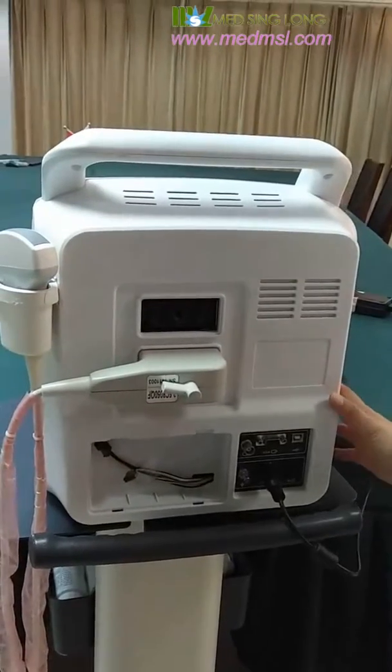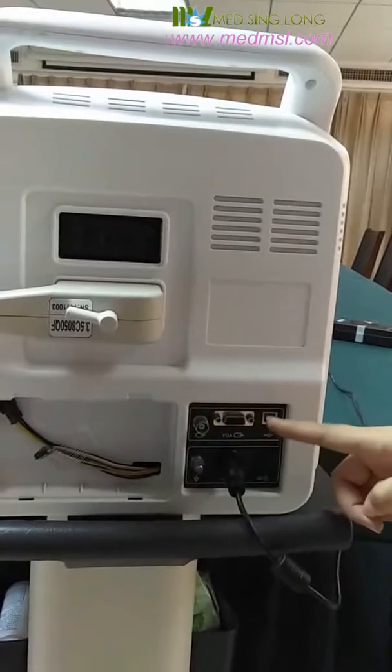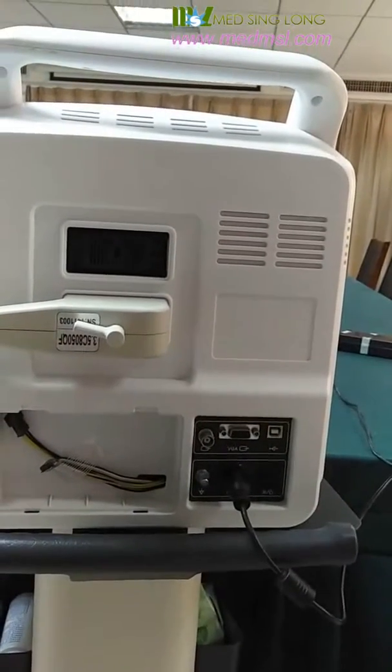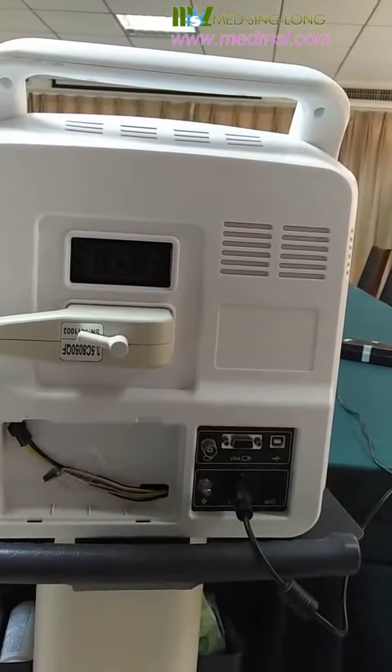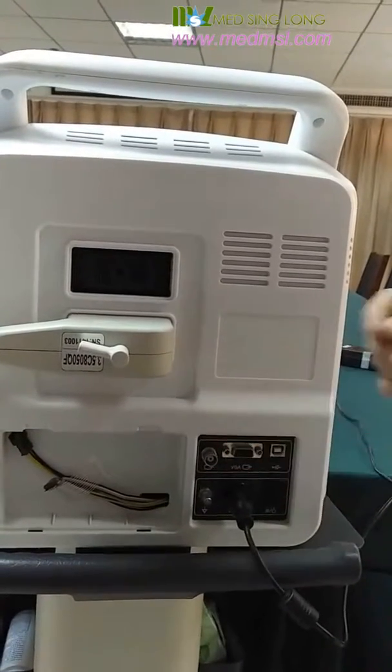This area is about the ports. You can see video ports here and VGA ports here. You can connect a video printer to this machine using this port.